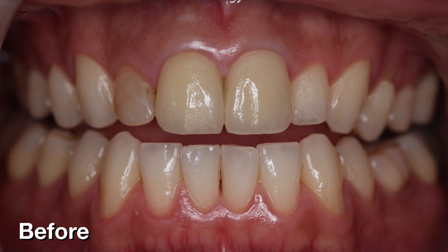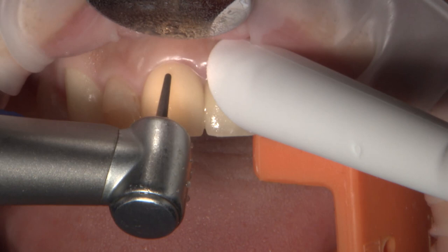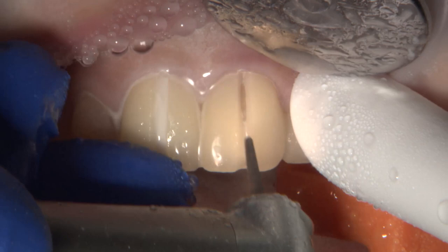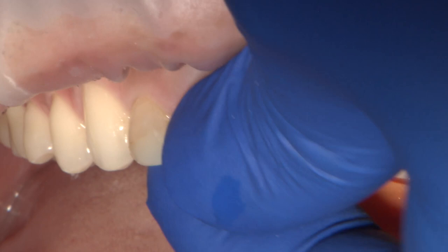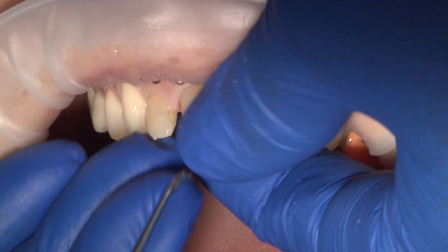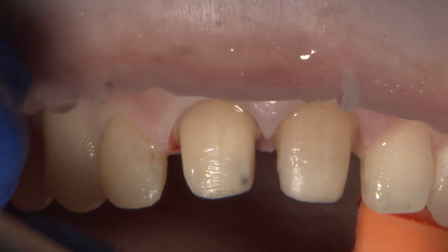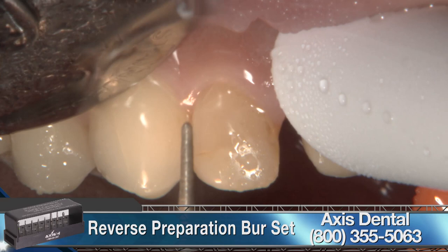Together with the patient, it was decided that a veneer could be added to the cosmetic treatment to balance out the smile and further protect the tooth. Anytime I see fractured teeth or chipped restoration in the aesthetic zone, my go-to material is a highly translucent monolithic zirconia, such as Bruxer Anterior. I proceed with the removal of the old restorations, using a zircater burr to cut through these bilayered old ceramic restorations. My treatment plan involved crowning 7, 8, and 9 with Bruxer Anterior, as well as placing a Bruxer veneer on number 10. I chose this material because this monolithic form of zirconia can endure the rigors of an intraoral restoration better than aesthetic core materials with veneering porcelain, specifically because there is no ceramic layer to chip or delaminate, as was the case with number 8.